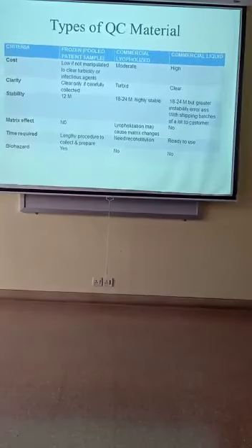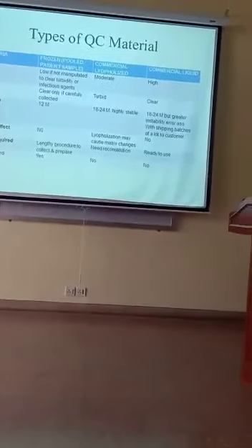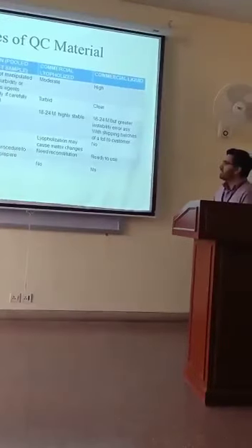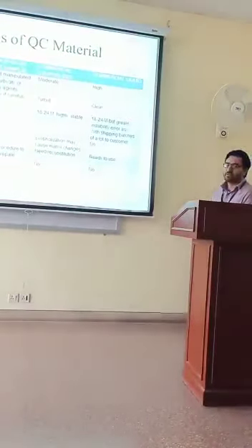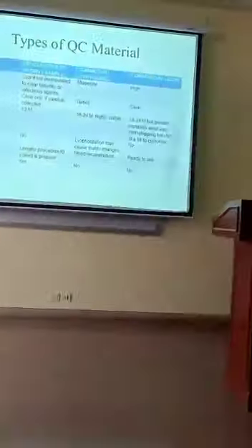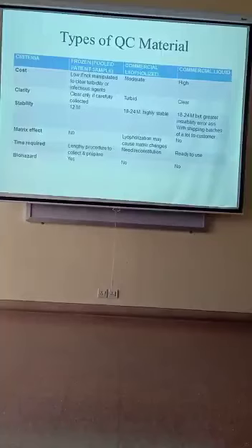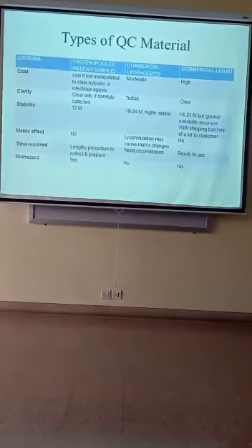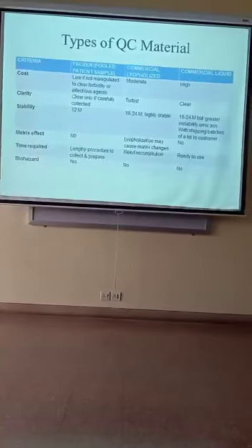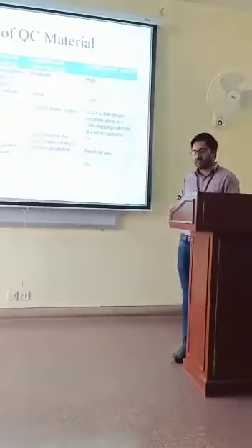The stability is 12 months for the frozen pooled patient specimens, and 18 to 24 months for commercial liquid. Matrix effects: there are no matrix effects in frozen pooled patient samples, nor in commercial liquid. But there is lyophilization error which may cause matrix changes in commercial lyophilized QC materials. Biohazard only in these specimens, because these are patient specimens, and maybe there are hepatitis B, C or HIV.